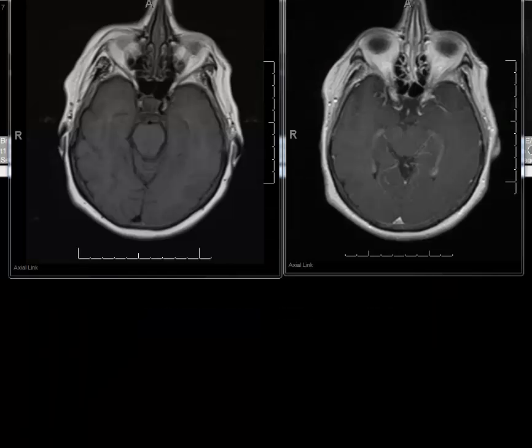In the next five minutes, I would like to briefly discuss the important MR pulse sequences that we use in our neuroradiology brain studies.